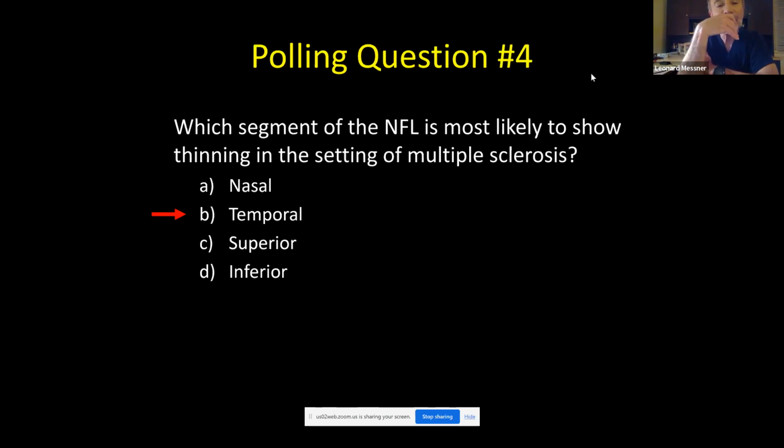A very simple way of saying that is, if the individual is showing worsening on the OCT, if their relapses are going up, and certainly if the MRI is suggesting an increased lesion burden, the answer is yes. Now, what about an individual that has an increasing relapse rate, the MRI is equivocal, but they're showing this progression on the OCT? Yeah, that is progressive disease.